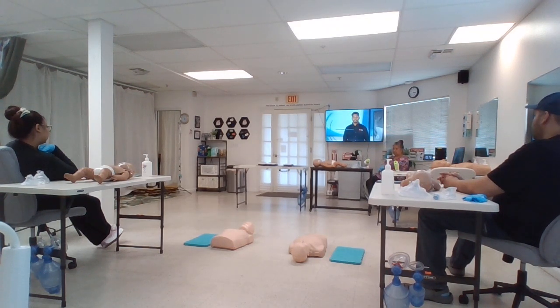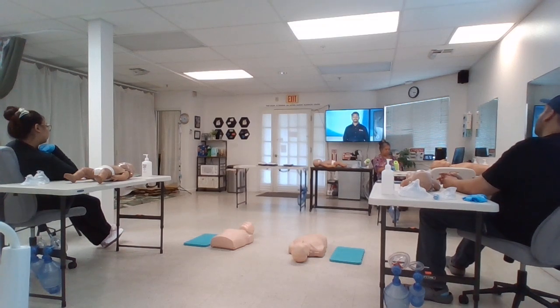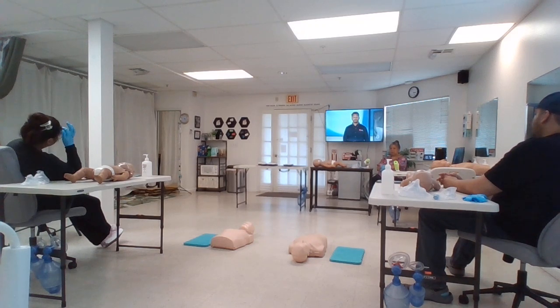In this practice session, you'll check for scene safety, check for responsiveness, practice chest compressions, and provide breaths by using your pocket mask with a one-way valve. You'll practice while watching by doing 3 sets of 30 compressions with 2 breaths.